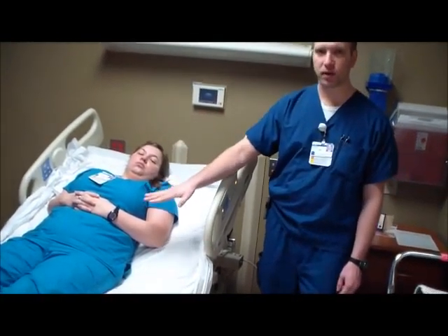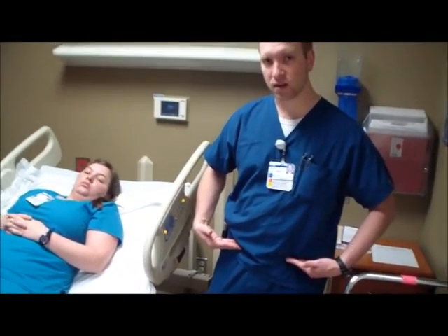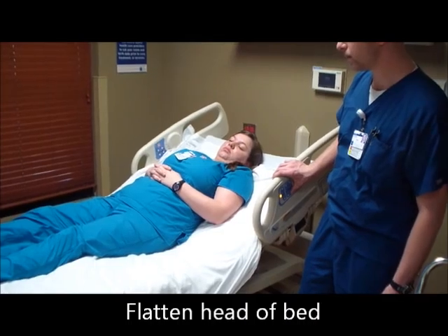You also want to make sure that the patient's not too flexed at their hips, otherwise this makes applying the CPM a little bit more difficult. So where Chelsea's at right now, that's a little bit too high. I'm going to bring her back down a little bit more.